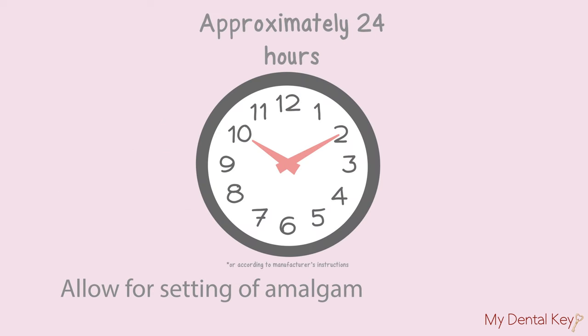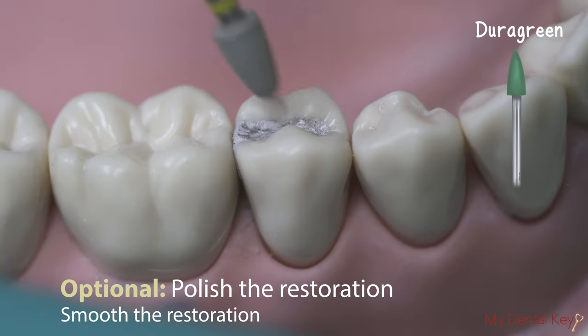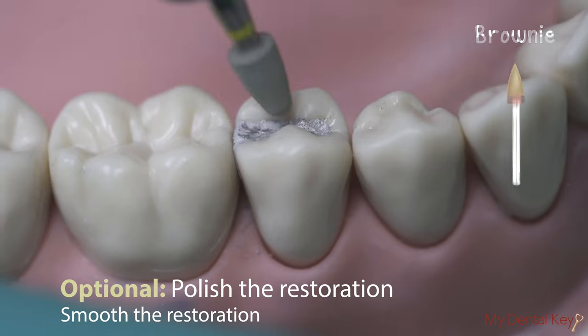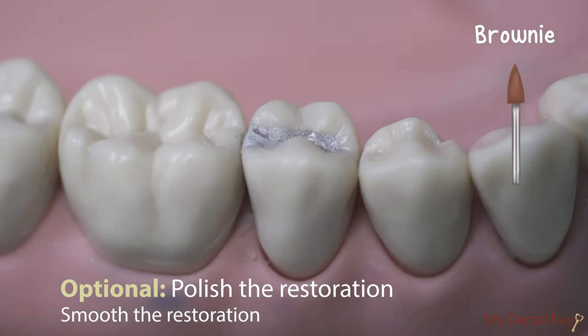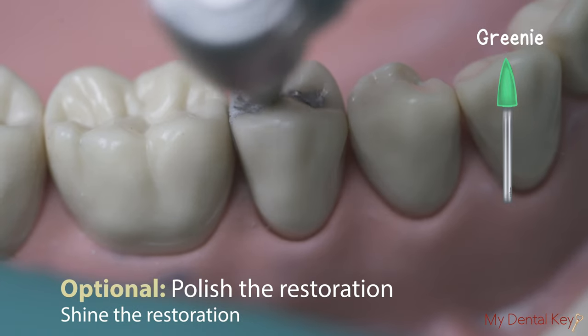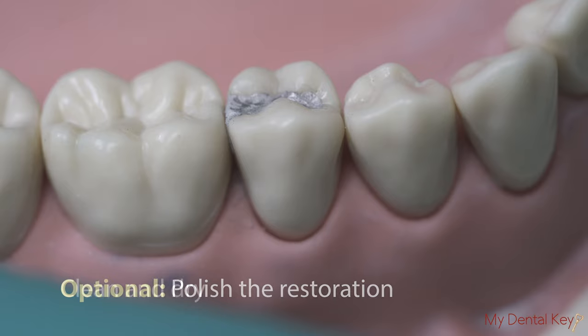After the amalgam has set according to the manufacturer's instructions, it is optional to polish the restoration. Smooth the surface with a duragreen or brownie polishing burr using rotary instruments at slow speed. Then, shine the surface with a greenie polishing burr using rotary instruments at slow speed.